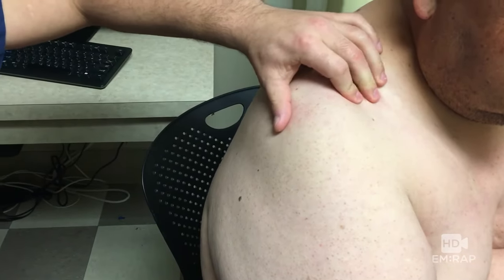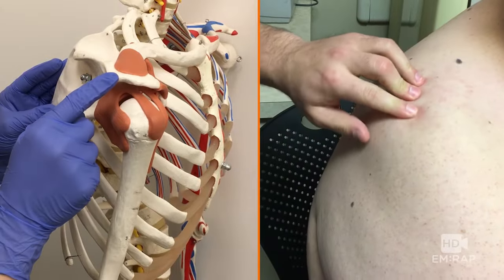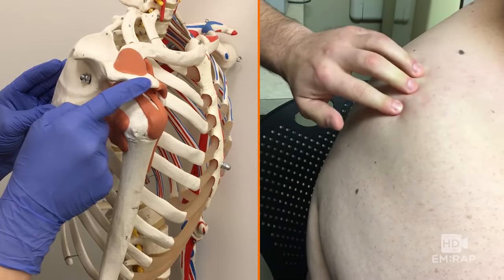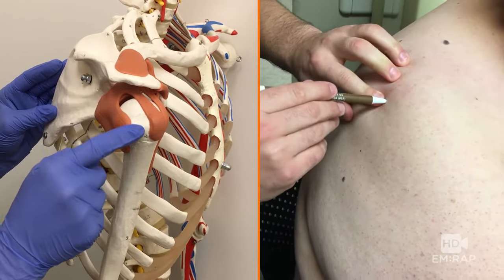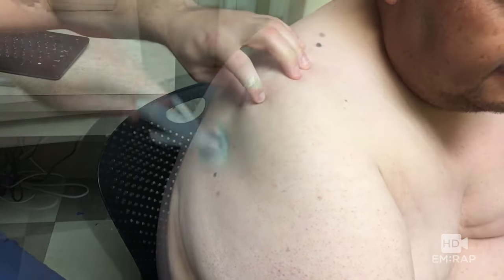To do a subacromial bursa injection for shoulder impingement syndrome, you're going to start by palpating the posterolateral aspect of the acromion and the humeral head, aiming for the depression between these. Mark your spot and prep the skin.